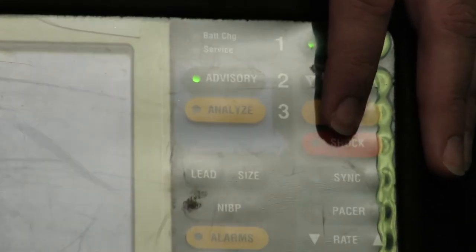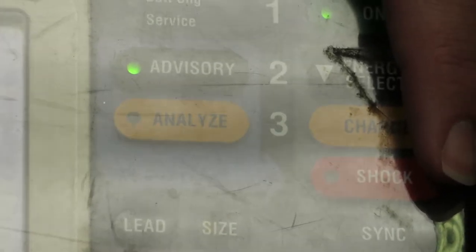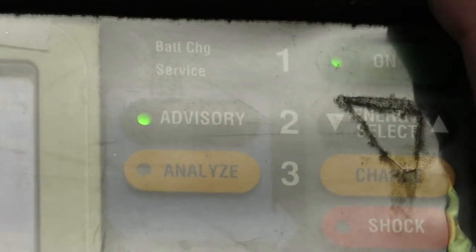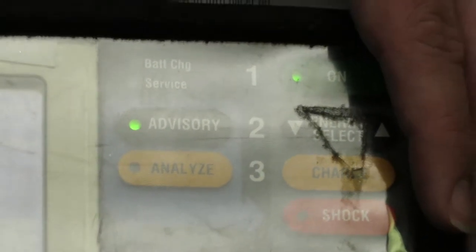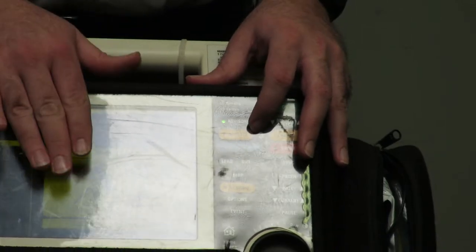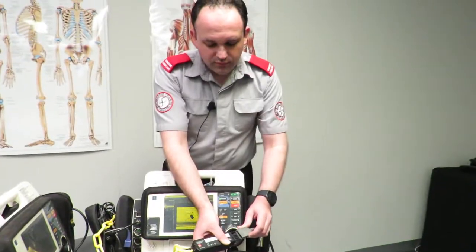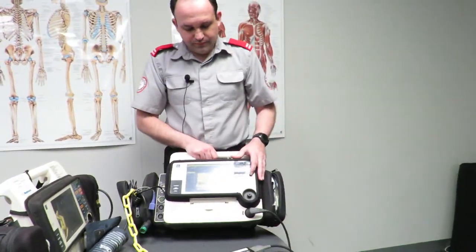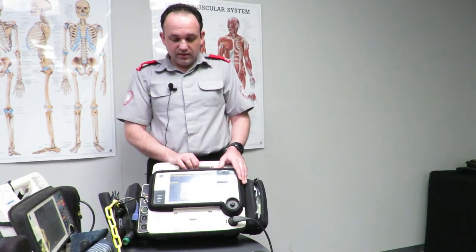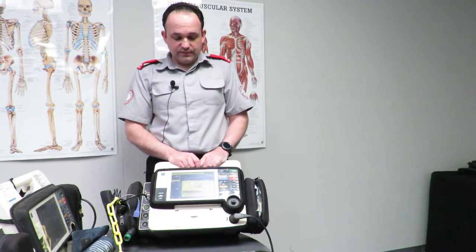To analyse the patient's heart rhythm, press the analyse button. It won't actually do it now because there's no patient and no paddles connected. But by pressing analyse it will analyse the heart rhythm and tell you whether a shock is advised or not. In advisory mode it will automatically charge up. The unit will prompt 'connect electrodes,' then 'push analyse,' then 'analyzing now,' then 'stand clear.' Because there's no electrical activity here, it tells us 'no shock advised — start CPR.'